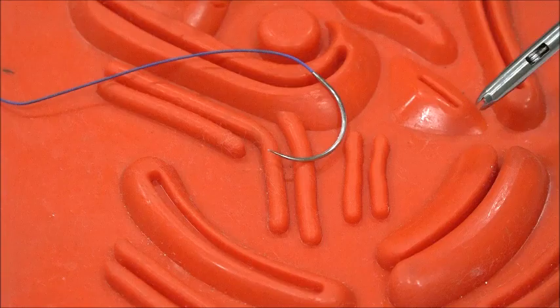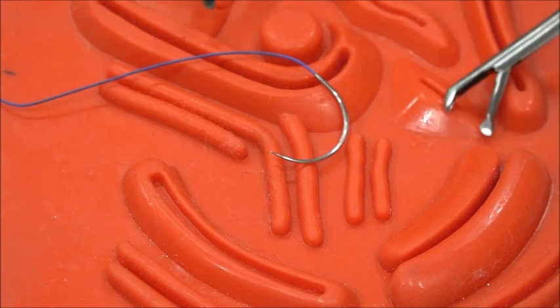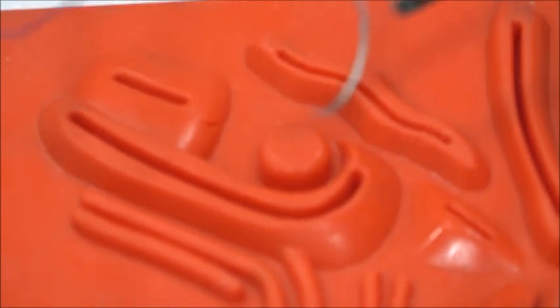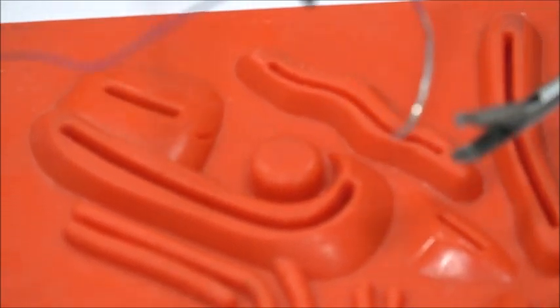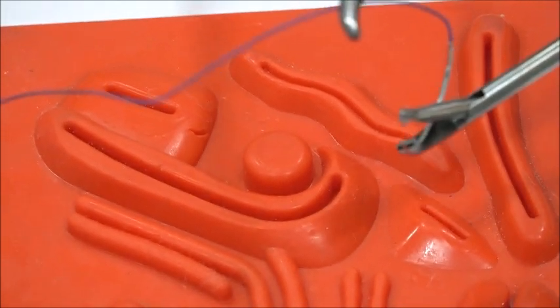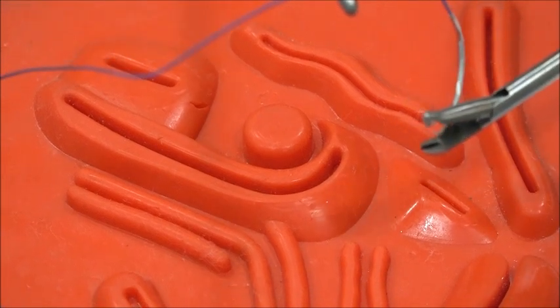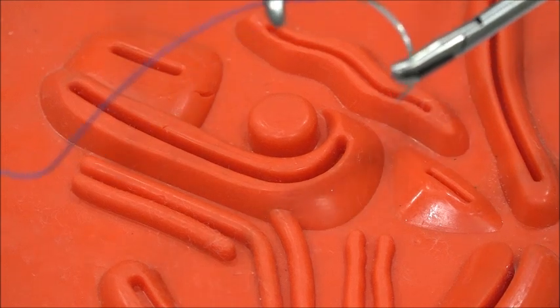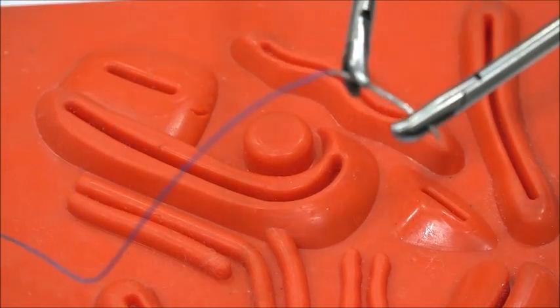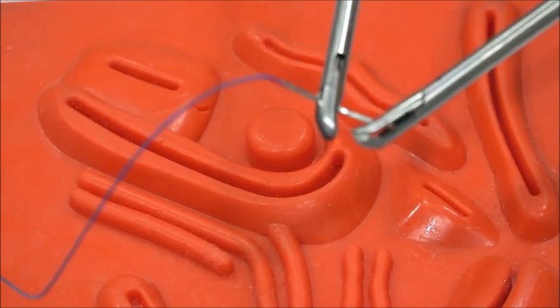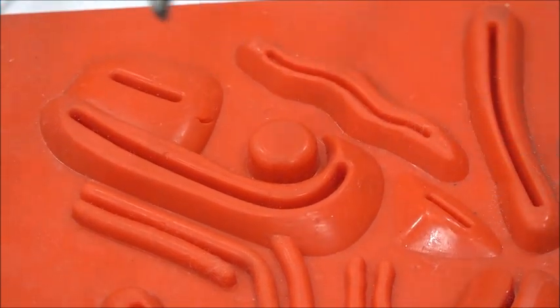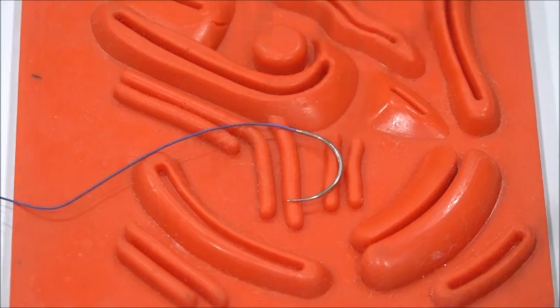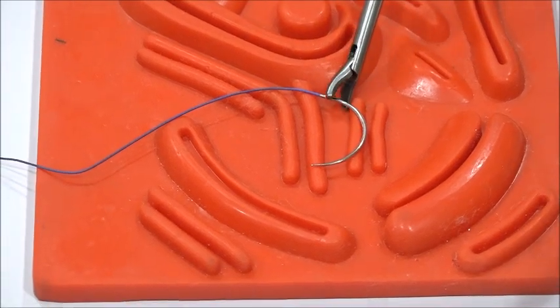In needle handling, the right grasper will hold at point A—that is 2 cm distal to the base—and the left grasper will hold at point B—that is 1 third distal from the tip. The right grasper will manipulate the needle for proper orientation and proper placement over the left needle holder. The surgeon will catch at point C with the right needle holder—that is distal one third. This will be the proper orientation of the needle. That is needle handling.